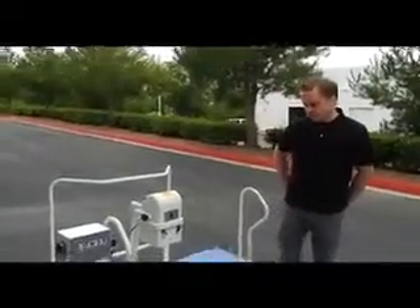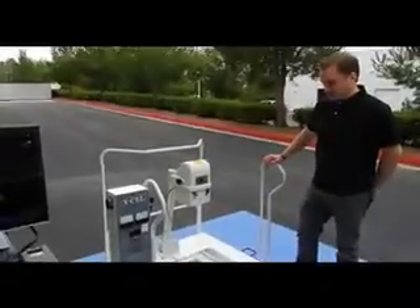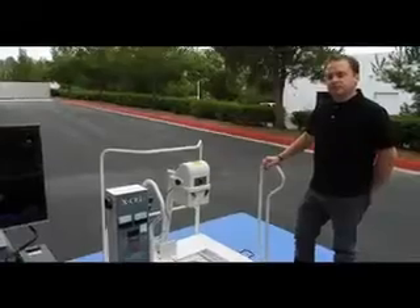Good morning, Josh here with Dicom Solutions. Just wanted to give you guys a quick demonstration of our podiatry system. This one's made by 2020, and there's two different styles that this podiatry system comes in.